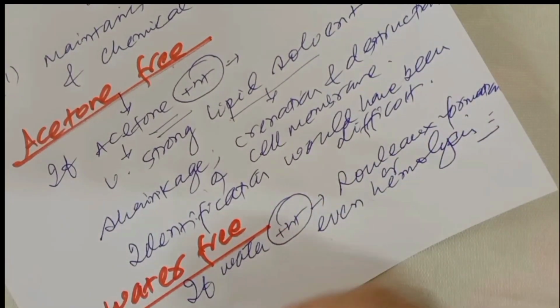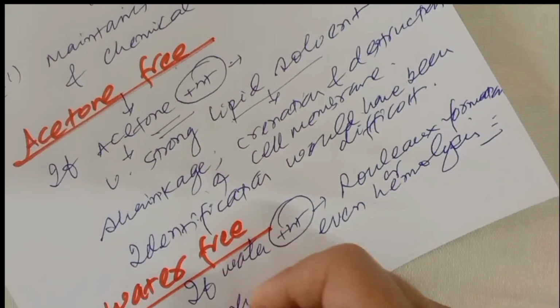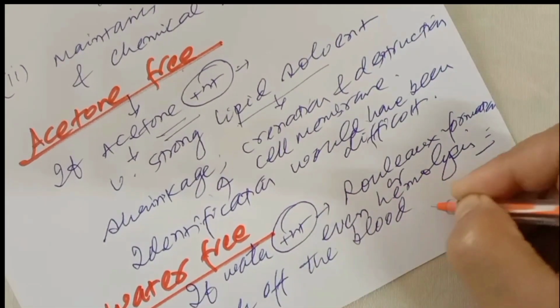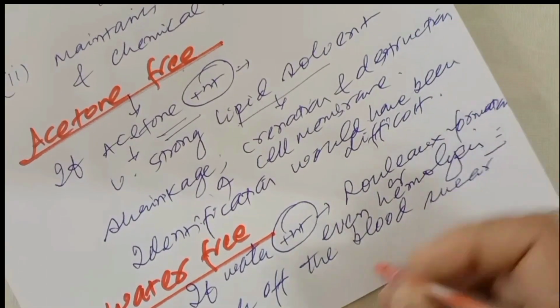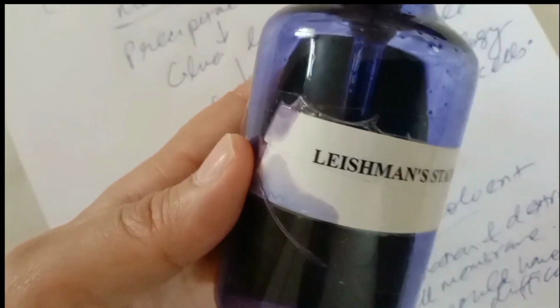And also, if water were present, it would wash off the blood smear from the slide.